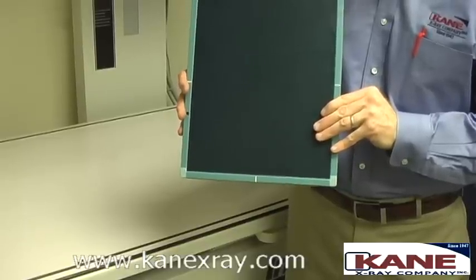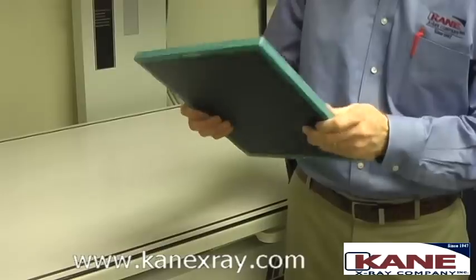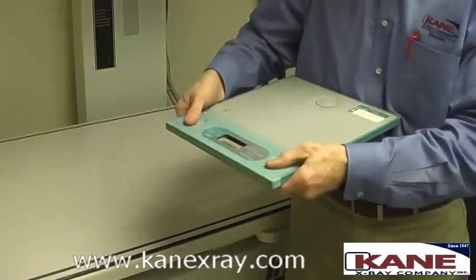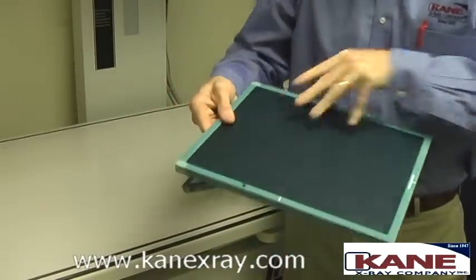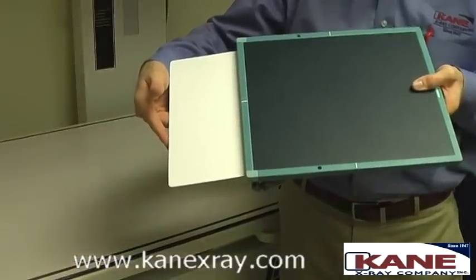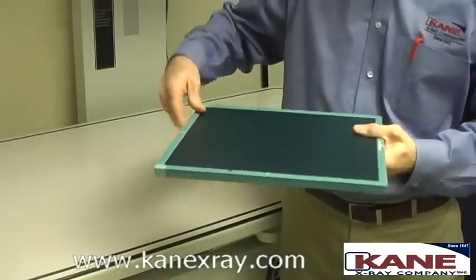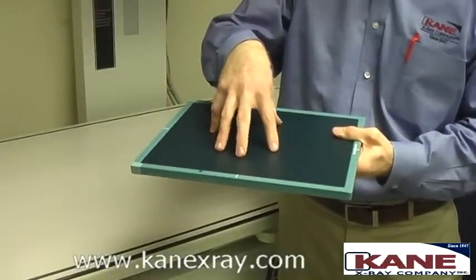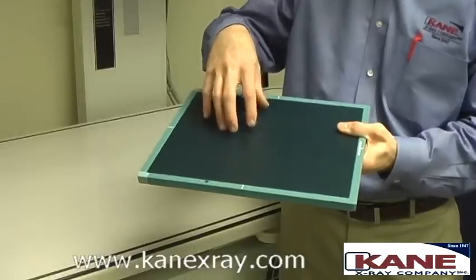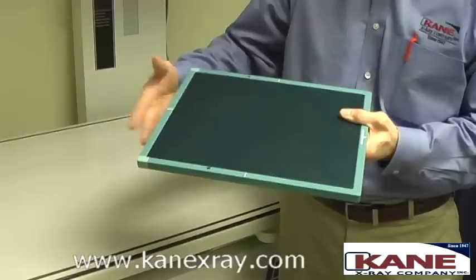The difference between the Fuji CR cassette and the film imaging cassette is the imaging plate that looks like the white crystals of the old film-based cassette. However, the difference is, in film, when these cassettes were hit with radiation, those crystals would glow right away, which would then expose your film. You feed it through the processor and you get a silver film.